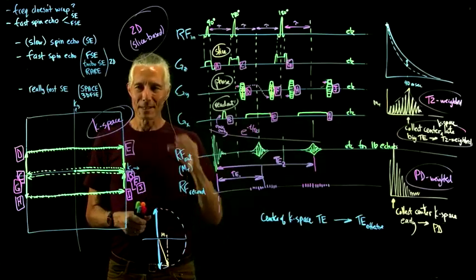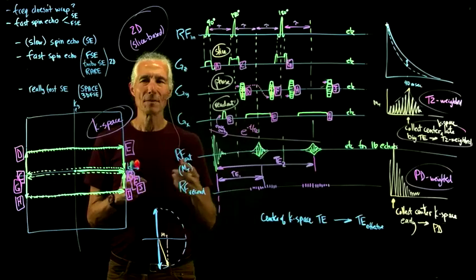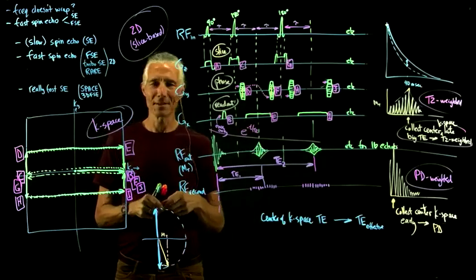Okay, so pulse sequences. Over the next week or so, we'll go over all these different practical modern pulse sequences.